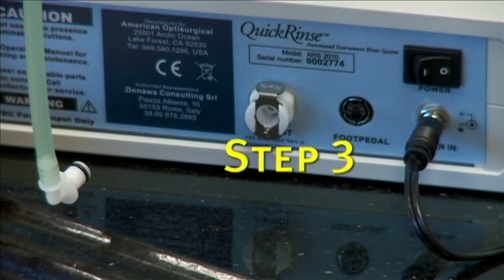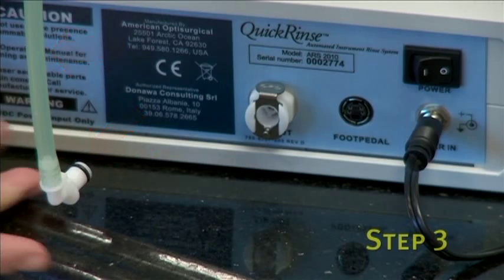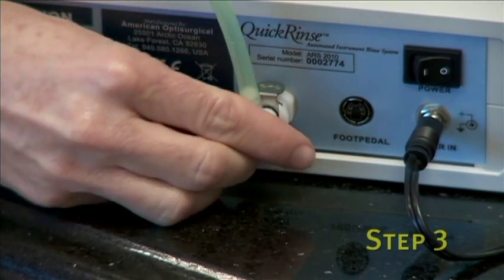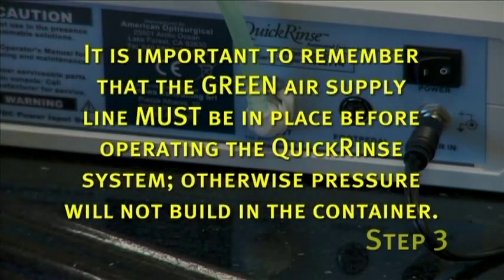The third step completes the green air supply line connection. Take the white elbow connector attached to the end of the green air supply line and click it into the air out connection on the back of the unit. It is important to remember that the green air supply line must be in place before operating the Quick Rinse system, otherwise pressure will not build in the container.